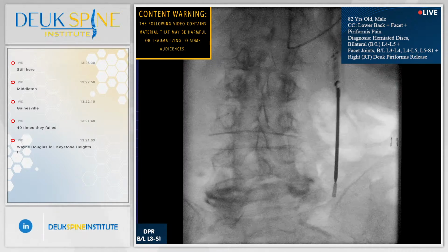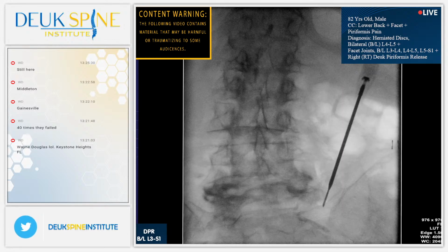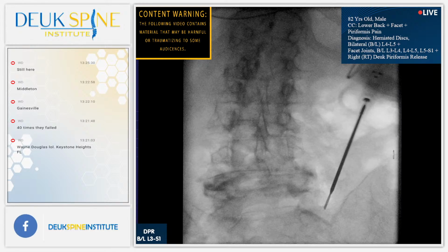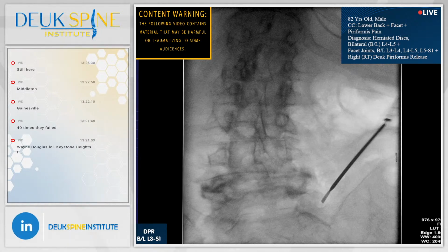Shot? Jordan, give me that 5-1 better. So this is a nerve that literally all it does is cause pain. Am I in the right spot? It looks like I'm pretty close. Probably could be a little more medial, but that looks really good, right? Shot? Uh-huh. That's perfect right there.